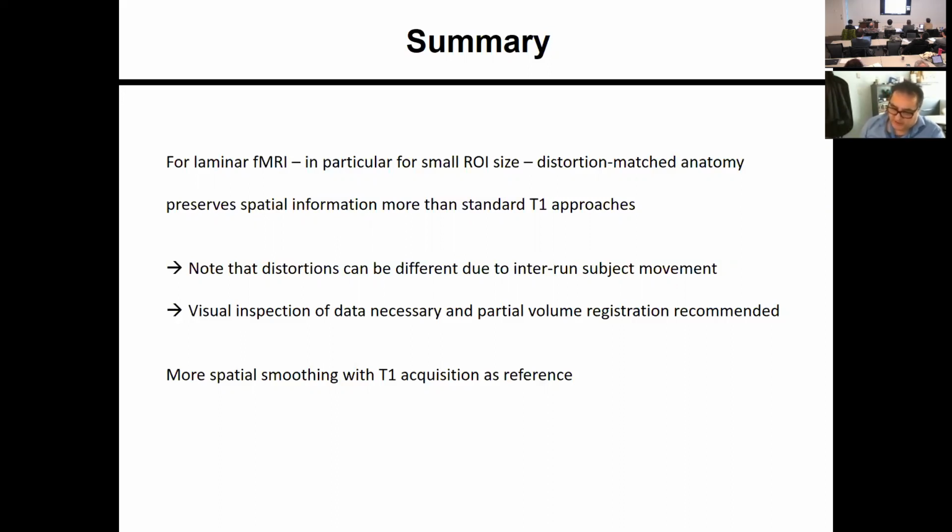In our experience, we did not necessarily use the FreeSurfer automatic pipeline because of all the small volume problems with FreeSurfer. So we used our own pipelines. There it worked out quite well. But your comment is certainly very valid, because if you have some automatic pipelines, there's something to be concerned about, whether the SNR is good enough. But in our experience, it was working out quite well for the pipelines we were using. Thank you.